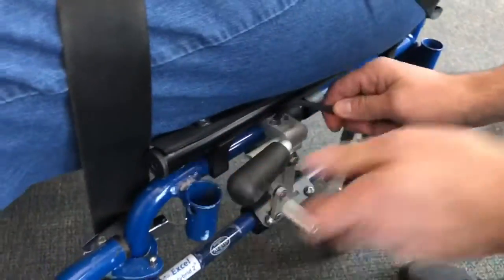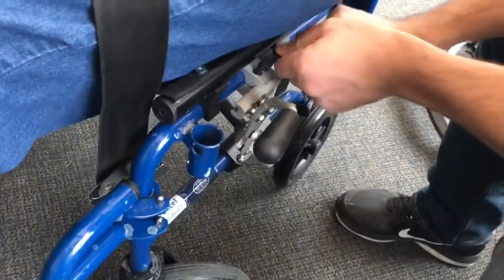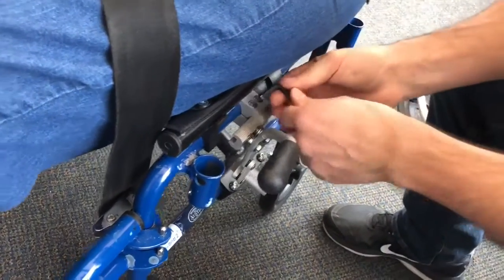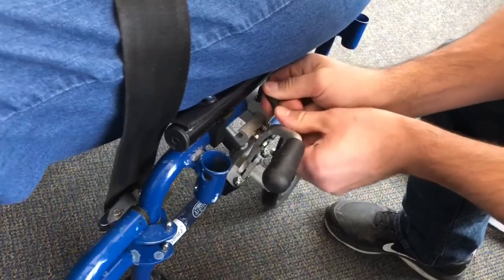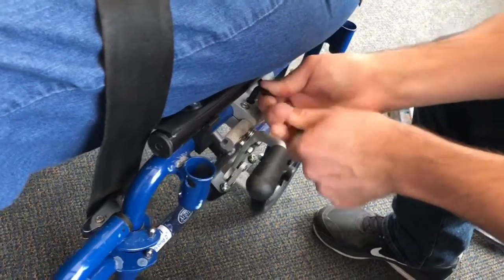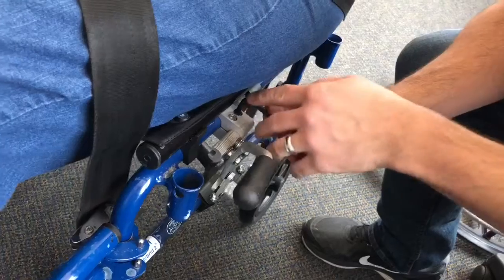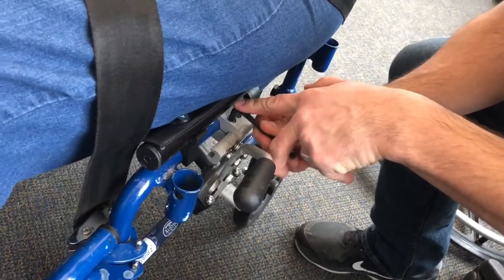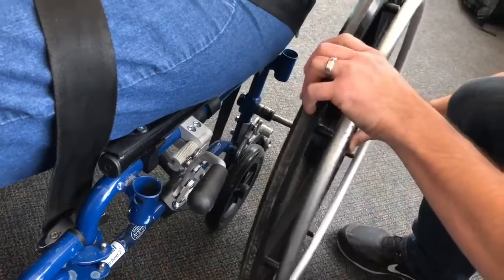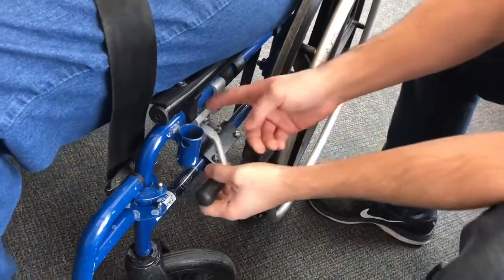So we're going to need an Allen wrench to take out these two set screws right here. Oh, there we go. So I'm just going to loosen these two up. There we go. Good. Now I'm going to go ahead and attach this wheel again. So I took the wheel off so I could easily access the brake to make sure that I could get these bolts off really easy.